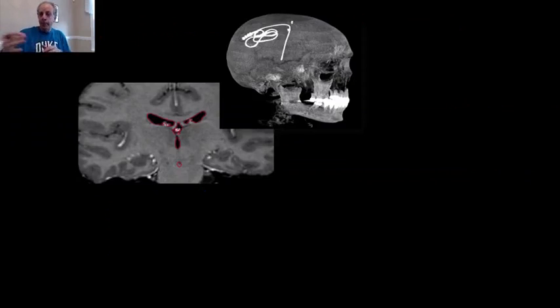And then at the end, the neurosurgeon did a lot of planning and basically says, okay, this is my target because you help me localize it, you help me figure out the connections. After surgery, the subject goes into a CT and we take a picture of this cable that is going to the chest for the battery, and this is the electrode that was inserted.